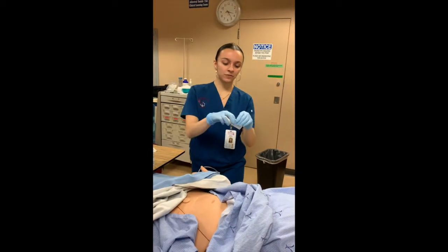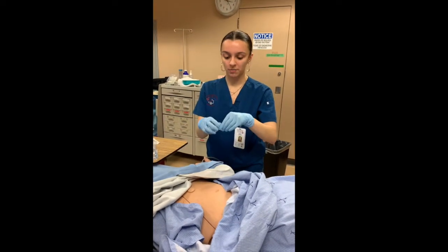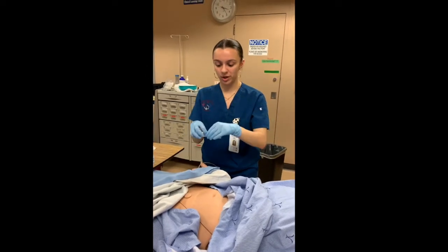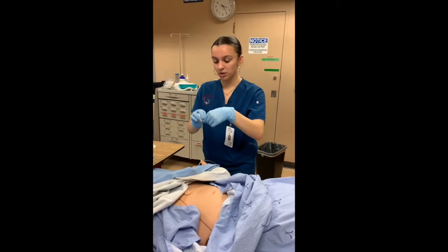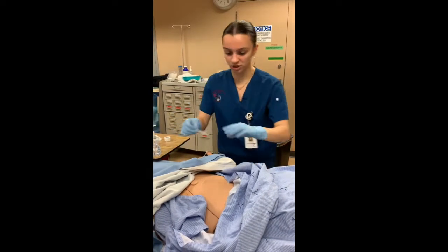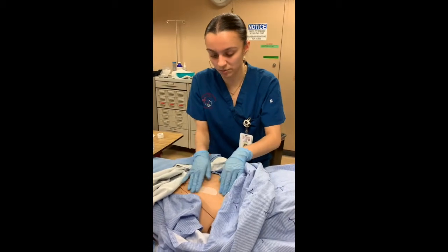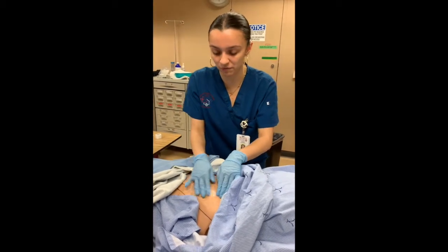So what you want to do after the injection, you would use a cotton ball or proper adhesion methods just to ensure that it's comfortable and no leakage or anything is coming through. So I'm just going to take some tape as well, and I'm going to put it onto the injection site. And usually you would put maybe a cotton ball or something like a softer material just to provide comfort.